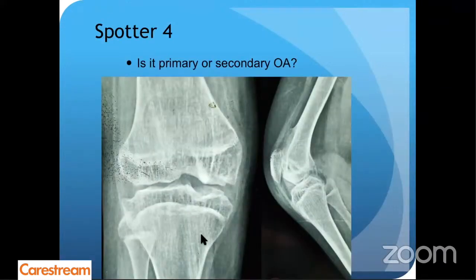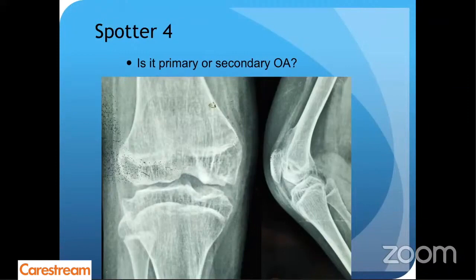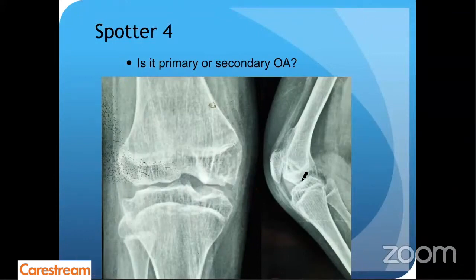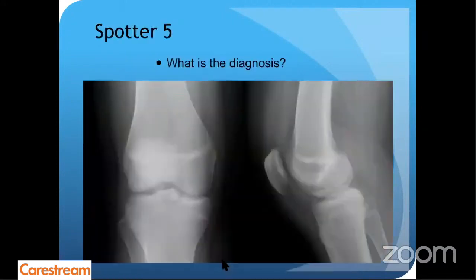Next — is this a primary or a secondary OA? Nobody is saying it's primary OA — very good. First, you can see there is a physis, so obviously this is a child. A child having primary OA is out of question. Secondly, you can see there is a lot of irregularity and erosions. So this was nothing but post-TB — that child had landed up into OA. So it was a secondary OA.